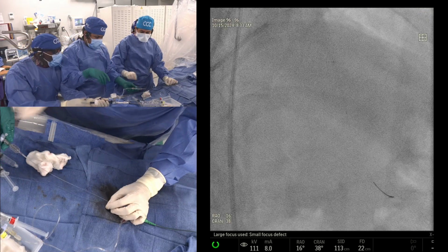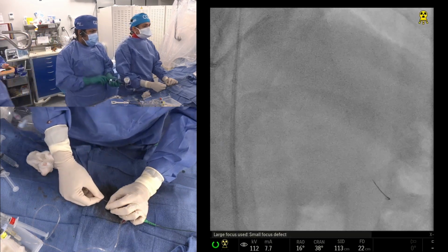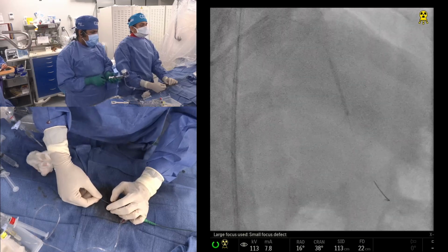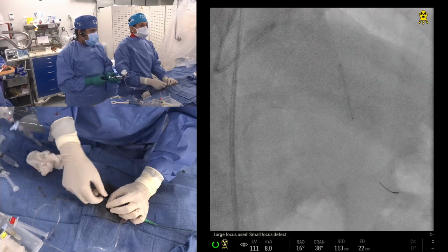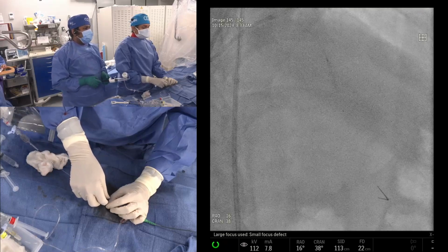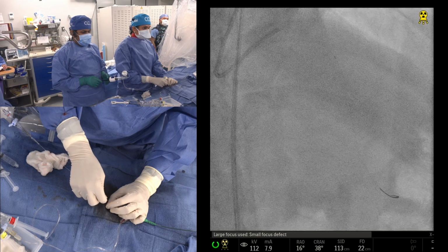This is how live cases should be: uninterrupted, high quality, three cameras. There is one from the ceiling demonstrating Dr. Kinney's finger movements, and then a frontal and a side view, all exceptional imaging. We are very happy with them.